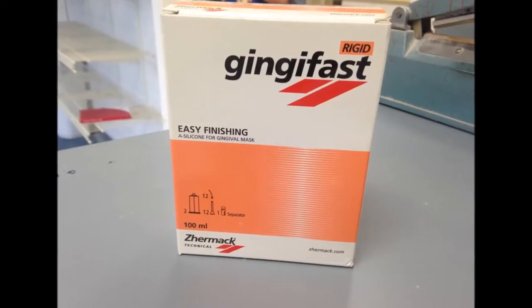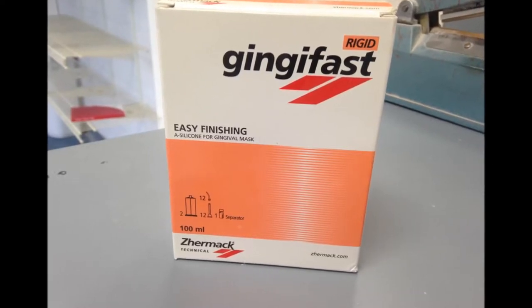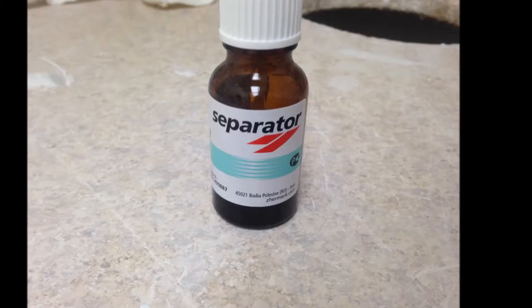For most cases within our laboratory we use Zermax gingifast rigid soft tissue material. This pliable but firm material allows us to remove and replace it many times without negative effects.